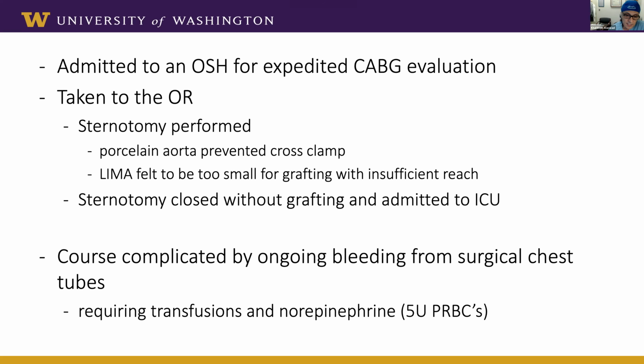And the RCA is a single proximal lesion. Yeah, it's angulated, but it's not really that difficult, right? And it's calcified. So in the SYNTAX trial, and in SYNTAX 2 afterward, a patient like this would have been fair game for either PCI or a CABG, right?